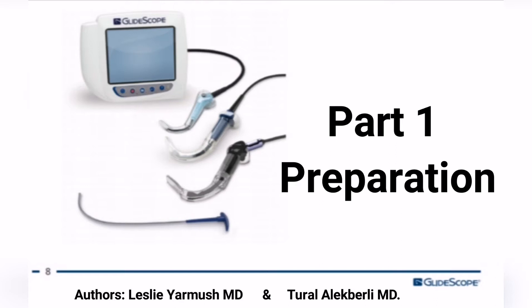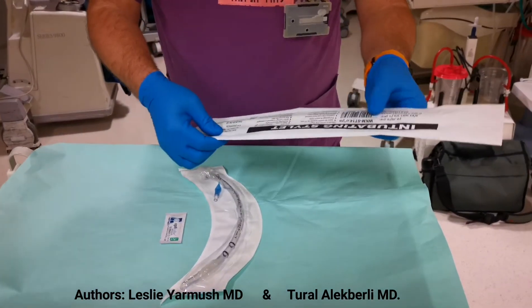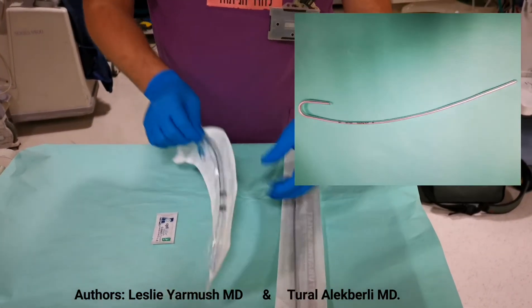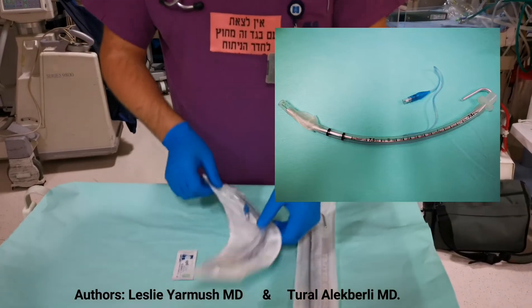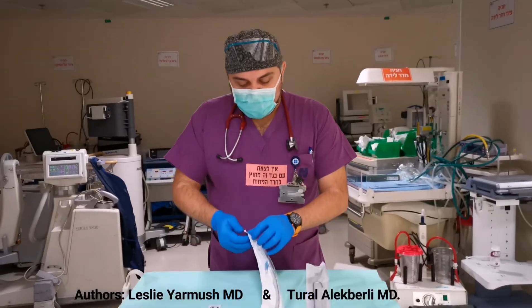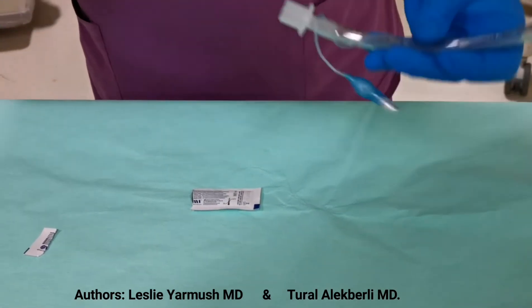First part: preparation and insertion of the special shaped stylet into the endotracheal tube. For preparation we need an adult intubating stylet 14 gauge, an adult endotracheal tube, and a lubricant or gel. We put some lubricant on the stylet and insert it into the tube.